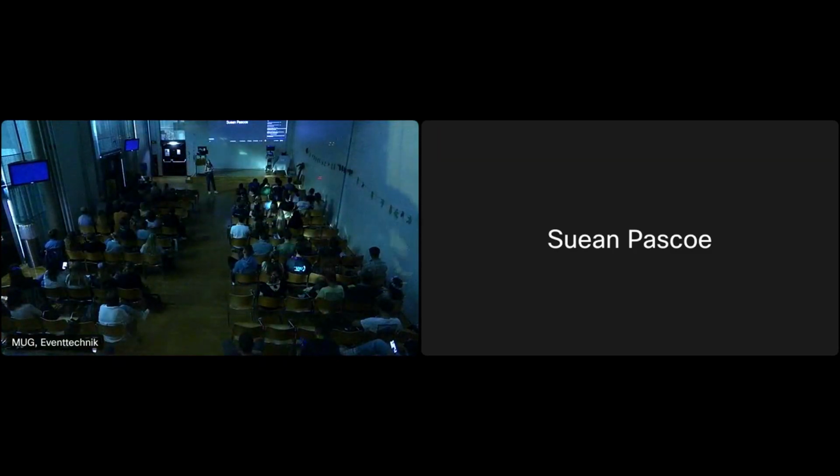You can go through a sequence of images to quickly get to the point where you think, are the pumps full? Is the tank empty? Is it a leaky tank and there's some problem where you're losing blood, or is it shock because they've got septicemia or something like that? So you go through that sequence of images in that undifferentiated shock patient, and it can help you get to the answer.